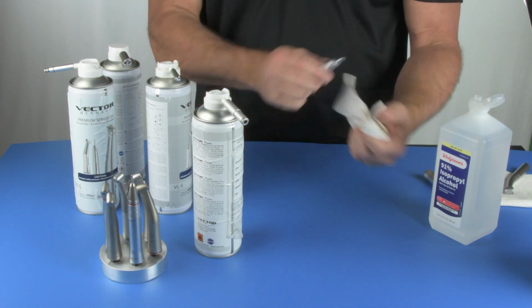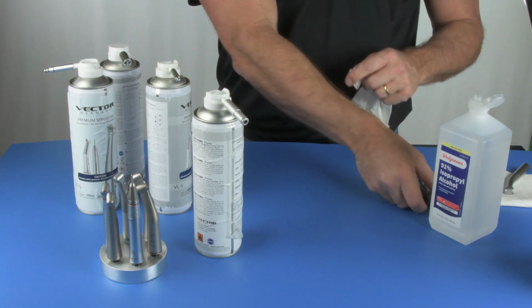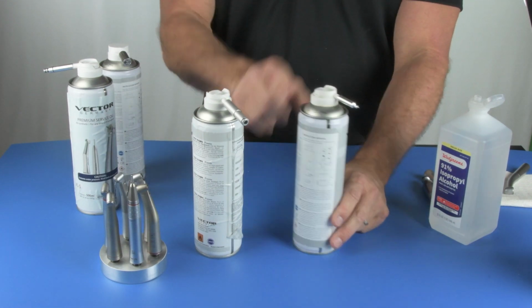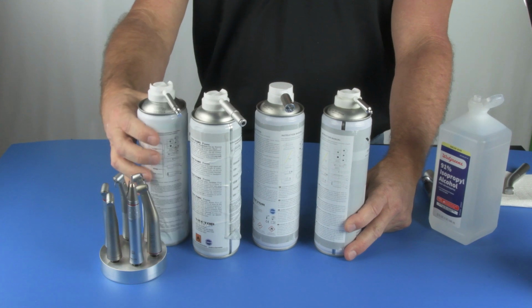Very simple. The procedure for sterilization and lubrication is pretty much the same. The difference is just making sure that you have the right nozzles every time, because that's the biggest error that happens.